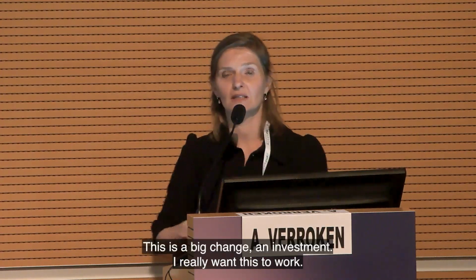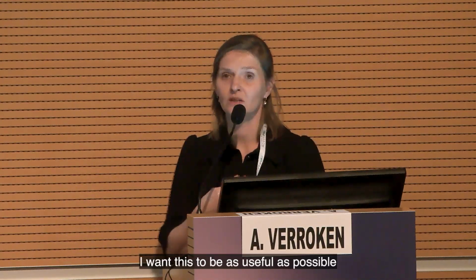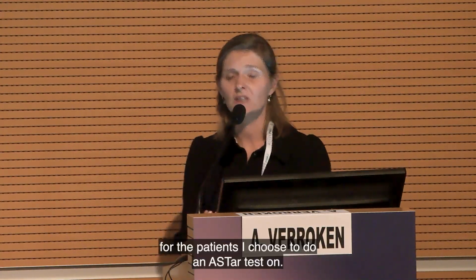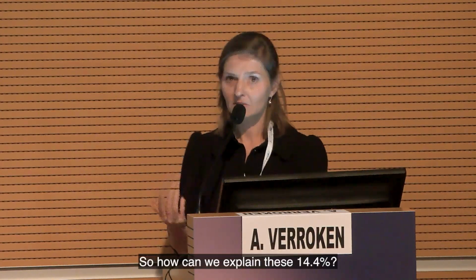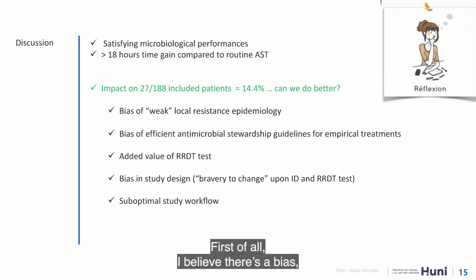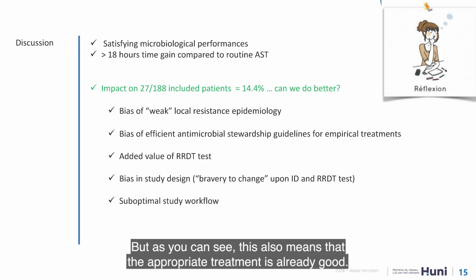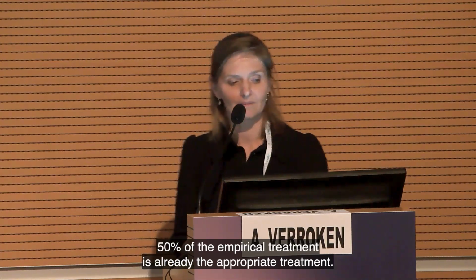Now, if I look at these percentages, 14.4%, I'm thinking, okay, nice, but can we not do better? This is like a big change, an investment. I really want this to work. I want this to be useful as much as possible for the patients that I choose to do an ASTar test on. So how can we explain these 14.4%? First of all, I really believe there's a bias due to the weak local resistance epidemiology, which is good to have not that much resistance, but as you can see, this also means that the appropriate treatment is already good. 50% of the empirical treatment is already the appropriate treatment.